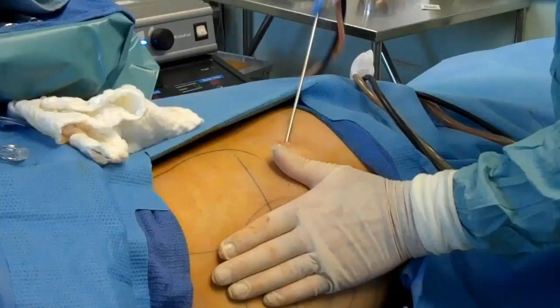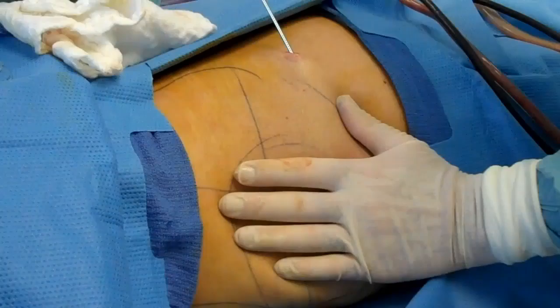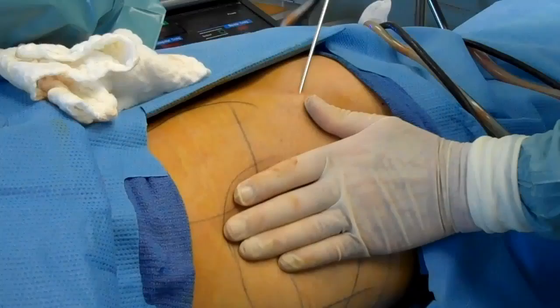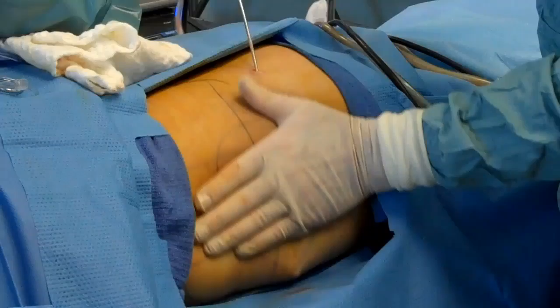It's a nice, easy movement — we're just going through and removing the fat that has been liquefied. I did these markings on her before she was standing up so I have a visual idea of where the fat is that I need to remove most. The circles mark the high points; I'm focusing on those a little bit more. I use my left hand to feel where the tip of the cannula is so I don't go too deep or too superficial.